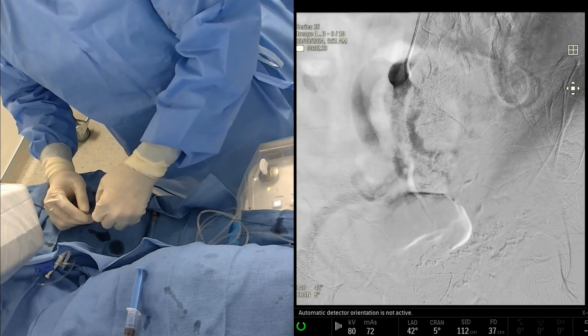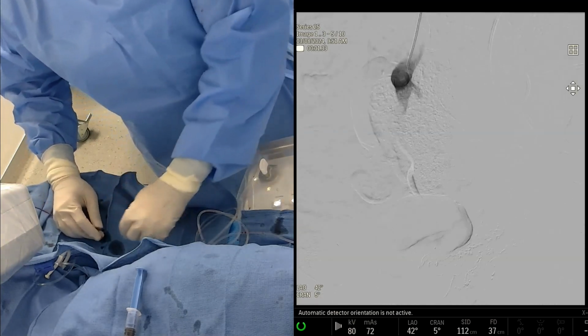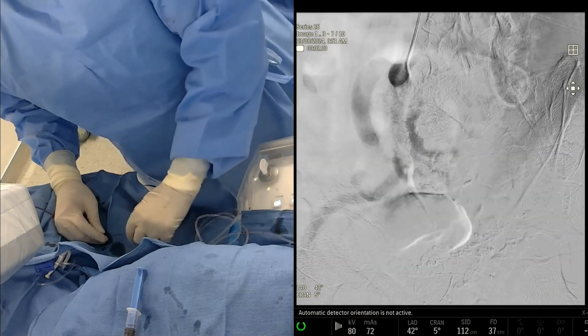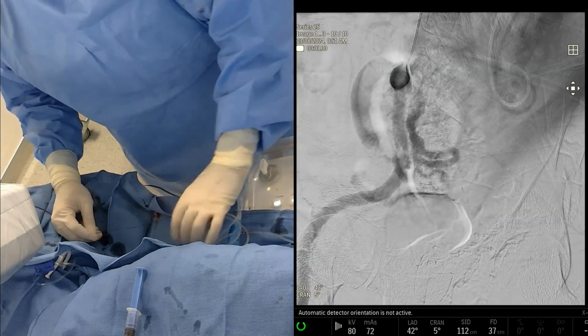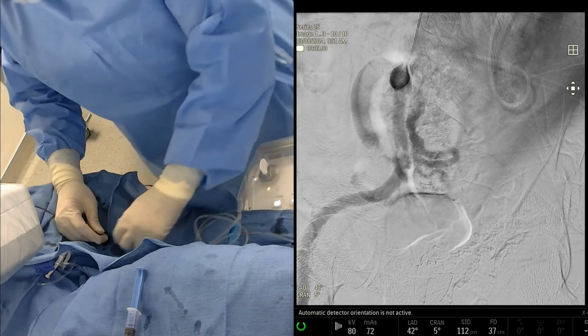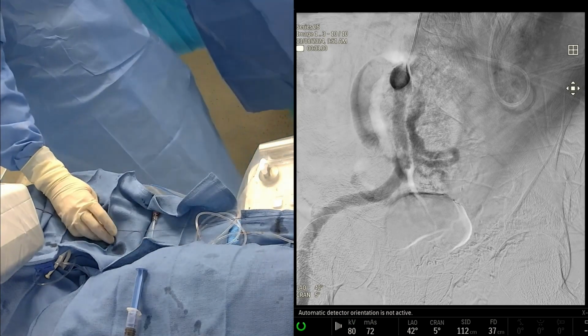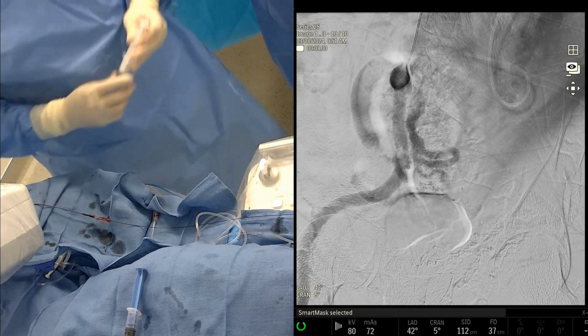I think only one, and that patient, I believe, Debbie, I'll take a smart mask, if I remember correctly, had a vessel that we missed initially. So it wasn't that the glue failed; it was just that we didn't locate the collateral, which I believe was off the umbilical artery, if I remember correctly.